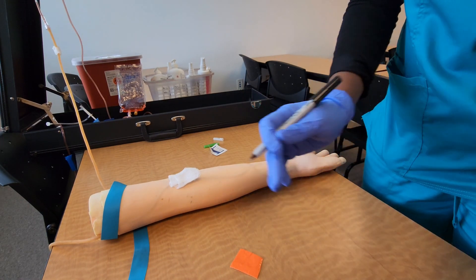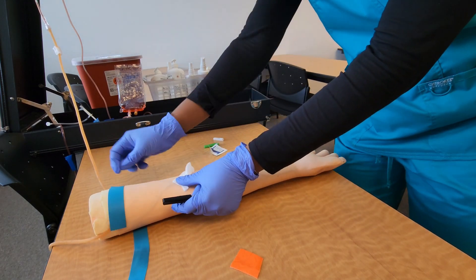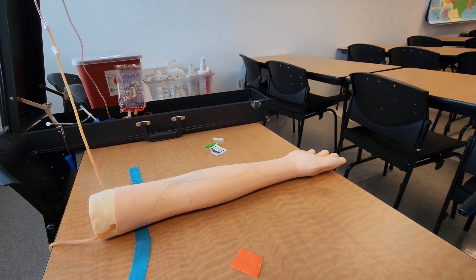While the patient holds pressure, go ahead and label the tubes, invert them several times to mix the blood with the additives, and inspect the puncture site to make sure the patient has stopped bleeding. Once they have, ask if they'd like a band-aid. If yes, apply it to the puncture site. If no, thank the patient and let them know they can leave.